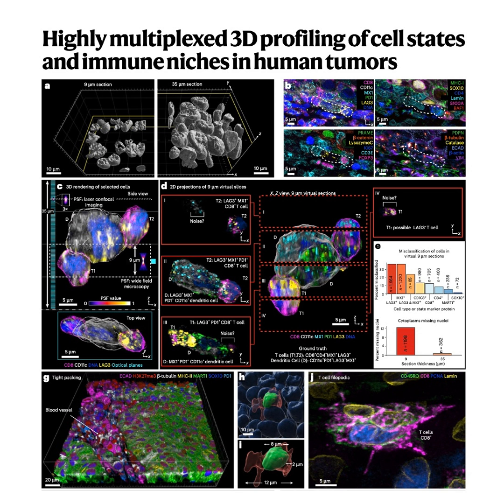Take that immune checkpoint protein, LAG3, we mentioned earlier. In 3D, they saw it wasn't just generally on the cell, it was often clustered in specific puncta, maybe 1 to 20 distinct spots per cell located both inside the cell and right at the plasma membrane, likely where it's functionally active. And you mentioned earlier that the location of a protein could indicate the cell's functional state.